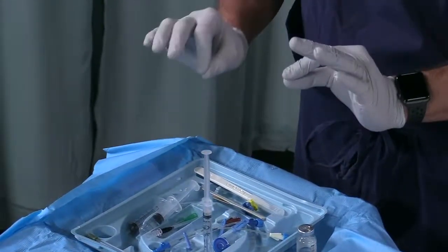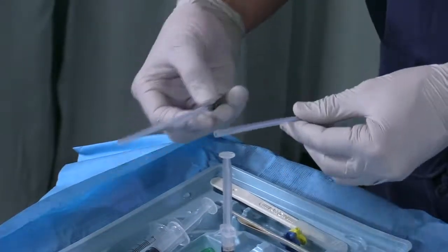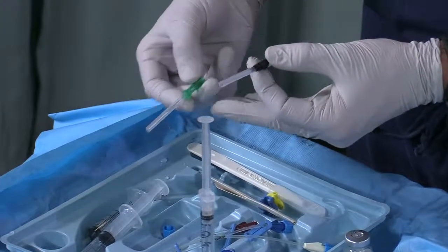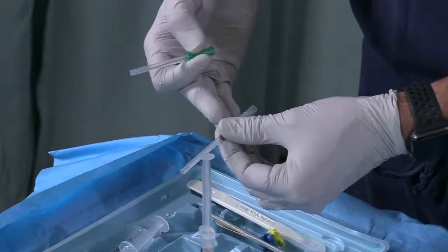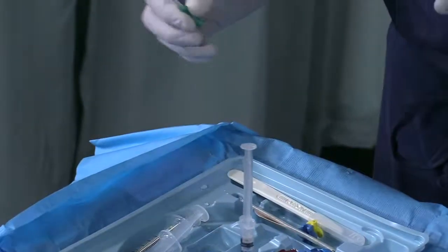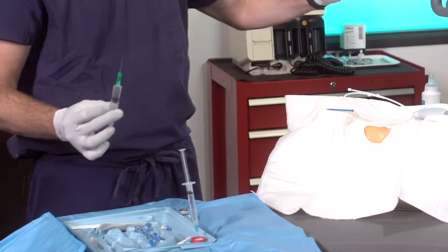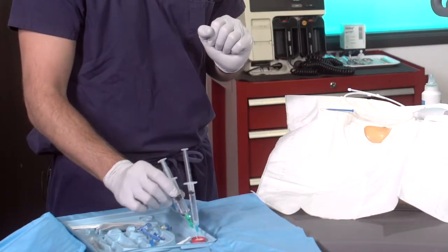There are a lot of different needles in the kit. These plastic ones are dilators — we're going to use the longer dilator, though you can use a shorter one if the vessel is superficial. When you look at the other needles, there are two different kinds. This one is your introducer needle — the needle you're going to use to actually find the vessel and then run your guide wire through. This other one is just a long angiocath you could use to cannulate the internal or external jugular vein; we're not using that, so set it aside with the smaller dilator. The introducer needle is your Seldinger technique finder needle — flush it a little with normal saline.